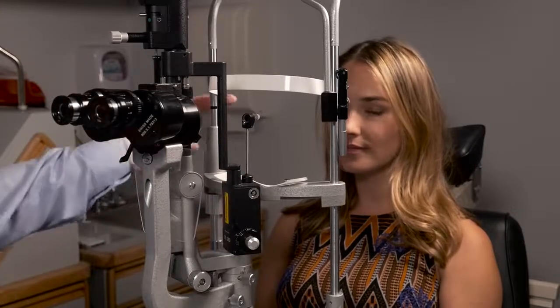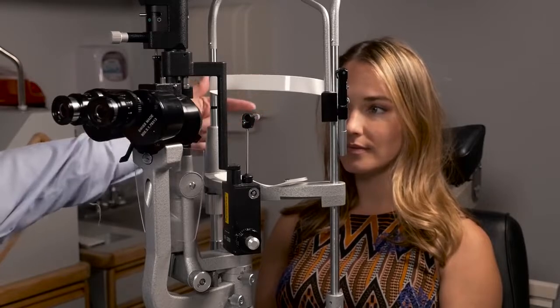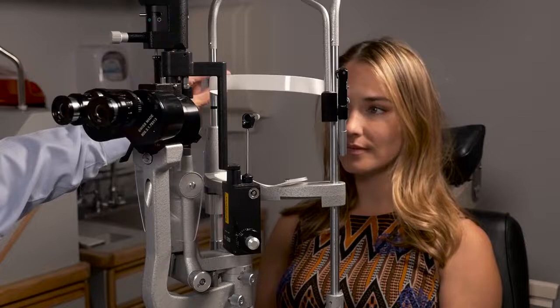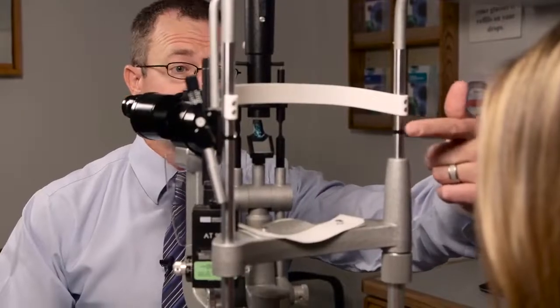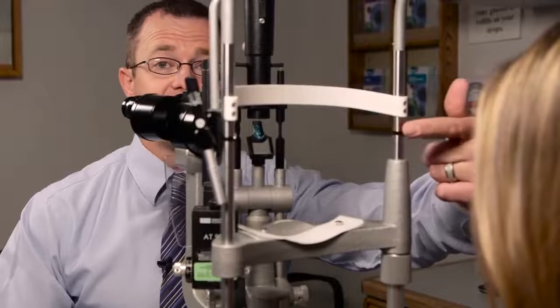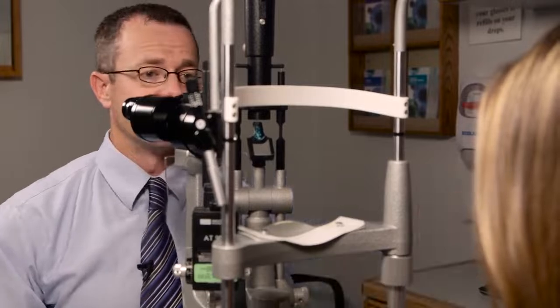However, you'll see a black mark here on the slit lamp. That needs to be level with the lateral canthus, or the lateral part of where the two eyelids come together. And so you're going to be lining that up so that their right eye is lined up with this black mark. And so that's one of the first key parts of getting a patient into the slit lamp.